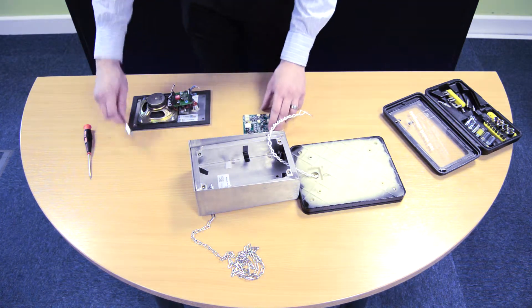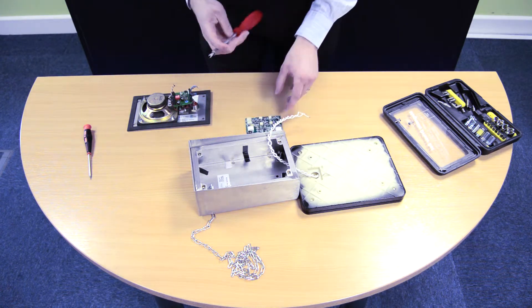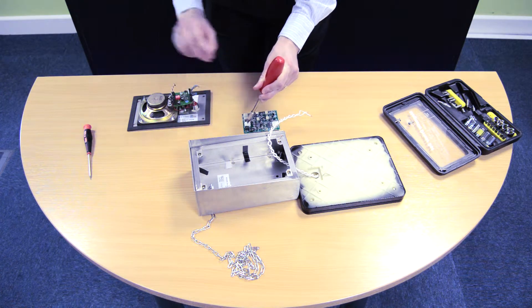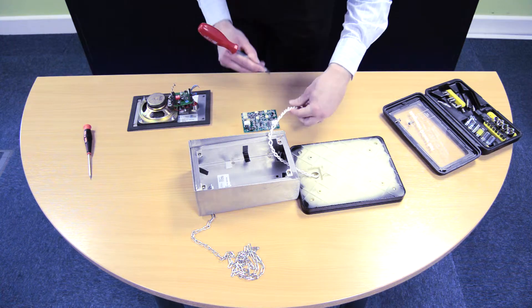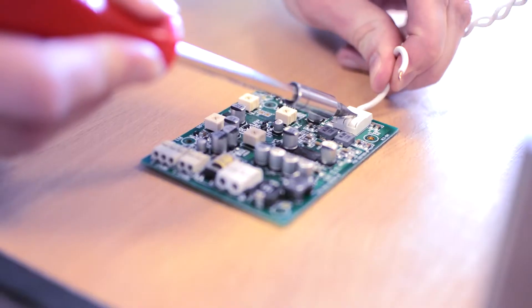The module features clamp connectors for easy integration. You operate these by pressing down and inserting the wires into the side. You can see we're doing this first with the loop output here, which is attached to our loop enclosure.